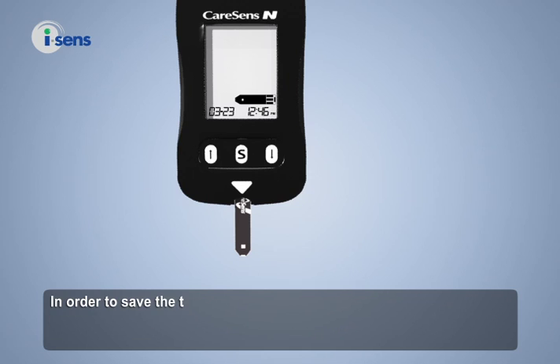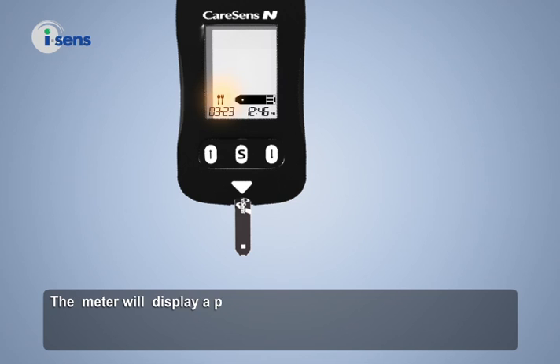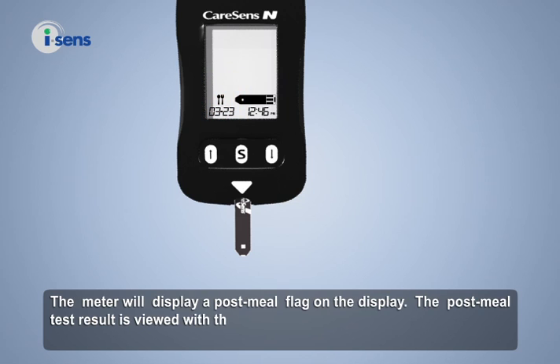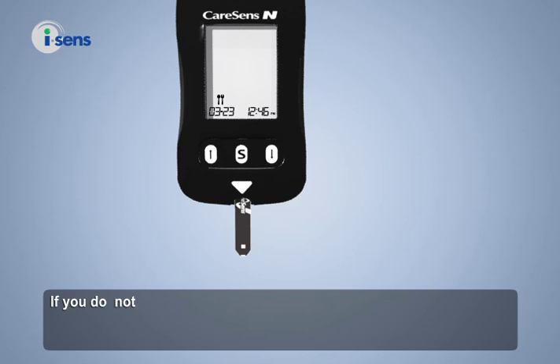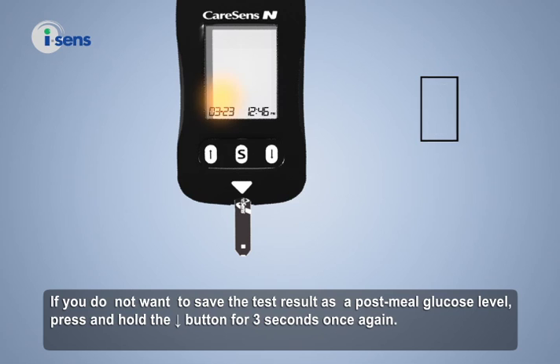In order to save the test result as a post-meal glucose level, press and hold the downward button for 3 seconds after inserting the test strip. The meter will display a post-meal flag on the display, and the post-meal test result is viewed with the post-meal flag. If you do not want to save the test result as a post-meal glucose level, press and hold the downward button for 3 seconds once again.